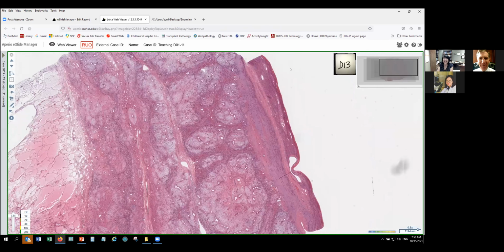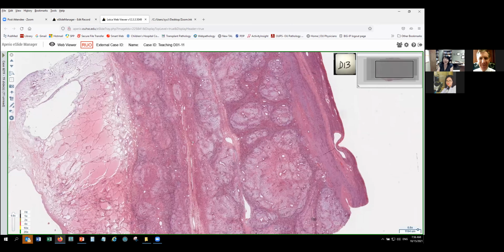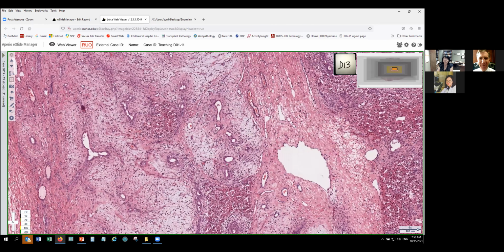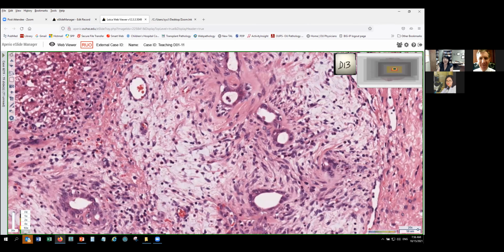Okay, now it's okay. So that's the low power view. That's the residual liver cells, hepatocytes. That's the normal residual liver, and that's the big mass. Well circumscribed but not encapsulated. And you can see so many pale nodules, and there's edema. Close look. So there's a cystic dilatation. All of those are bile duct dilatation, irregular bile duct dilatation.